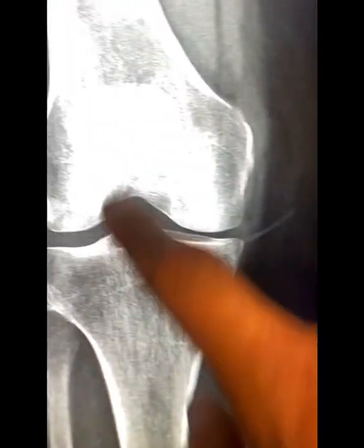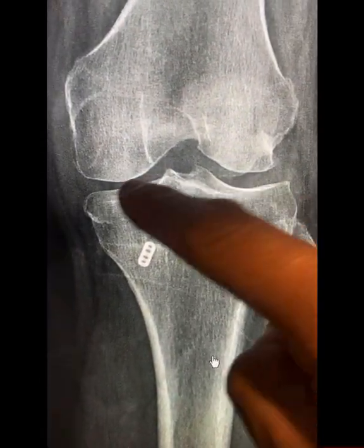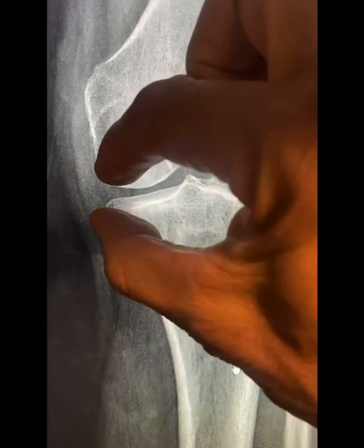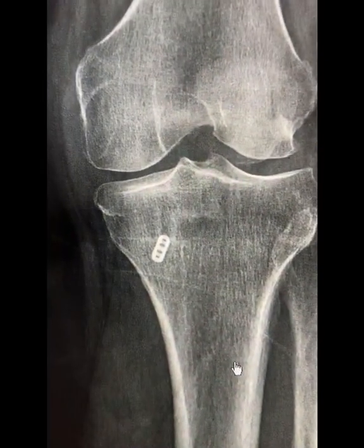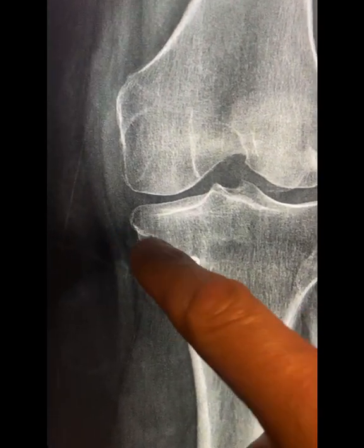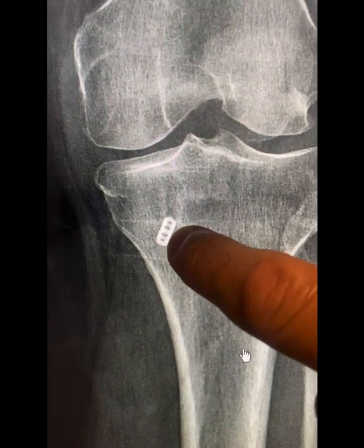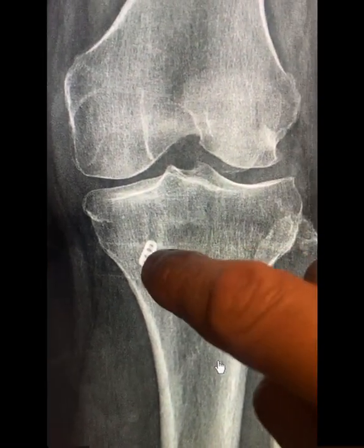I take the opposite knee for comparison purposes. What I'm looking for when I see these follow-up patients is the joint space — I'm seeing if there's any narrowing. In this case, there is very minimal if any narrowing, maybe a little bit of thickening of the bone. The button that is used for the root repair is in perfect position.